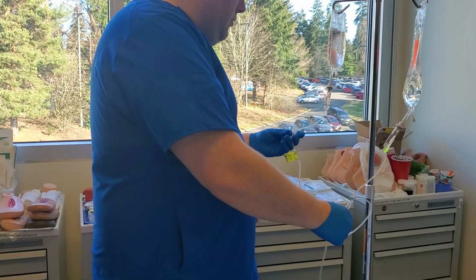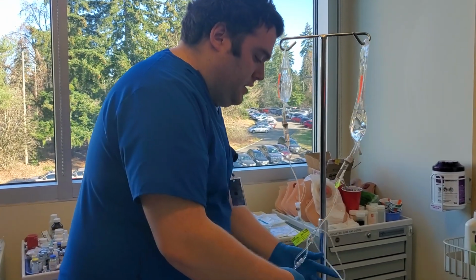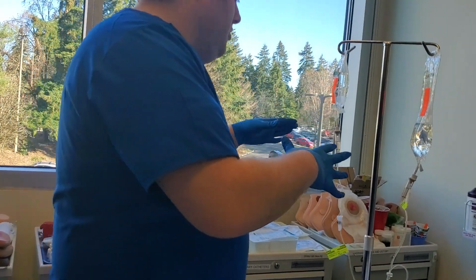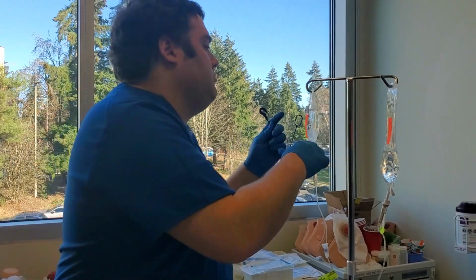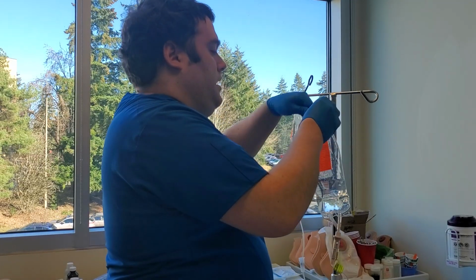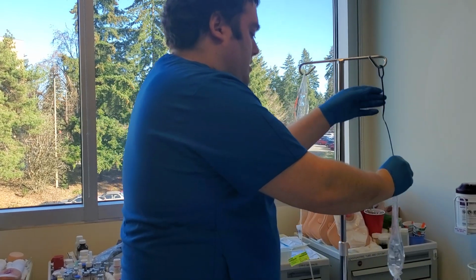Then we'll go ahead and we will open it. And so then we're checking it, if it's going well, observing the flow. We will go ahead. Actually, what we would have done, though, this was an error on my part. We will have gone ahead and hung this. A big error on my part.